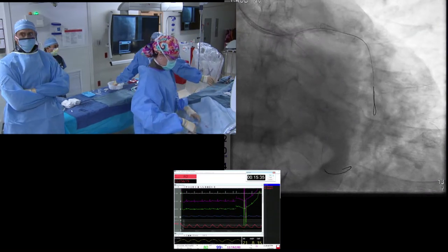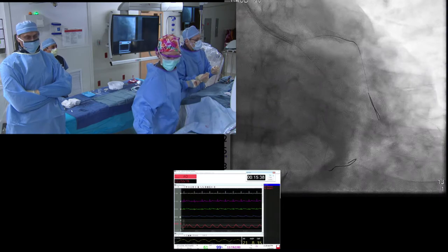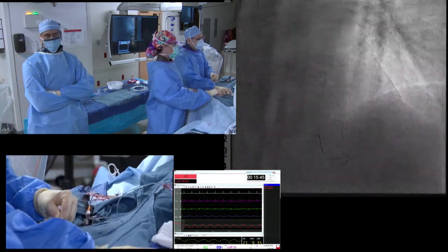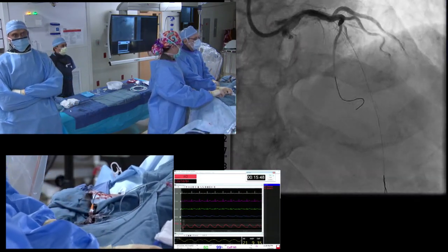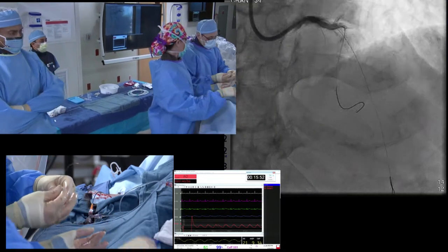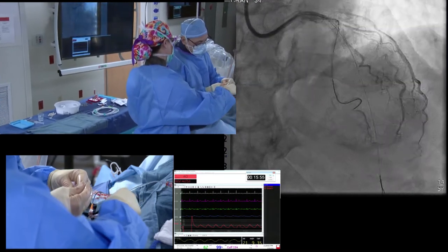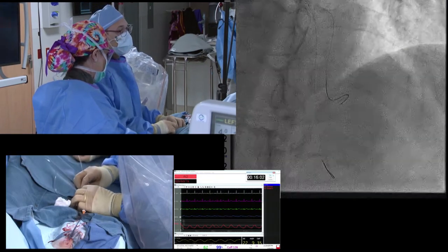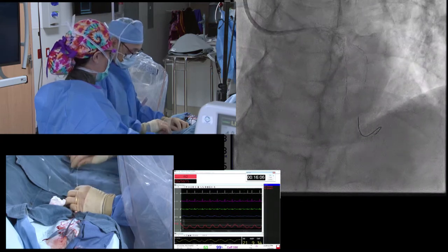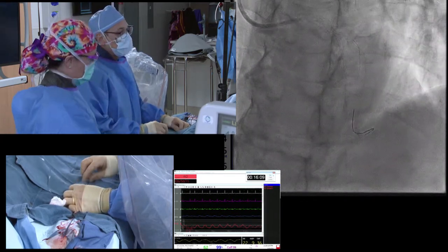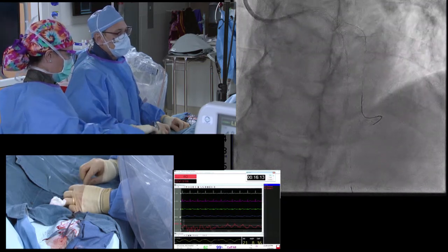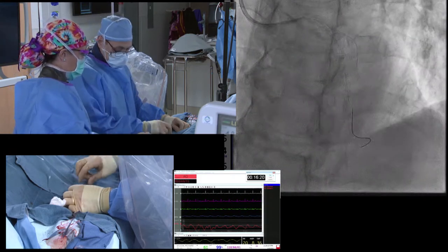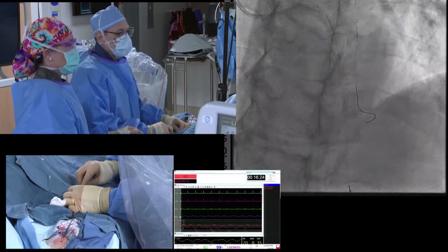We'll restore flow and then proceed. If you go to the cranial view you can see that just having the wire in is limiting flow — this is a tight lesion. Let's go to the LAO cran so we can see the lesion a little bit better. We're going in with a 2.0 NC balloon to try to restore some flow.